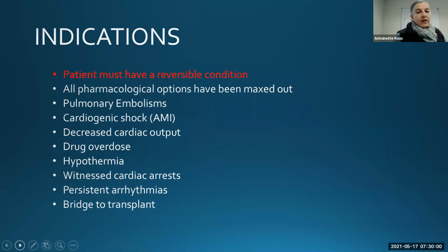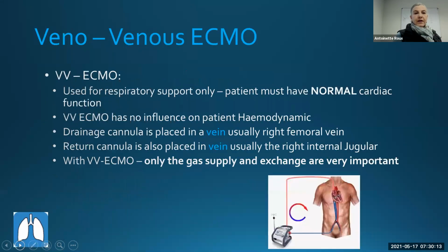So if your patient is in serious cardiac failure, you must know that you are going to put him on a program where he's going to receive an LVAD or an impeller, or he's going to have a new heart. Okay, so that's VA ECMO.